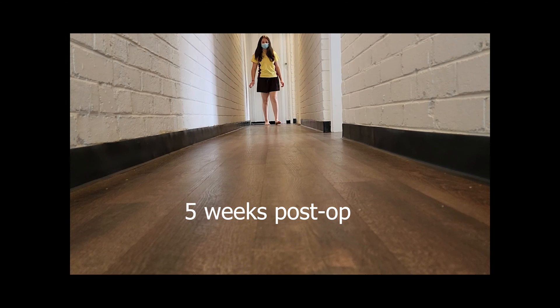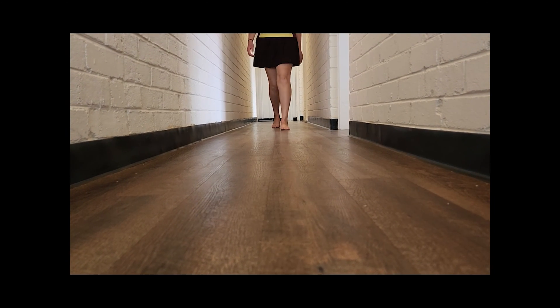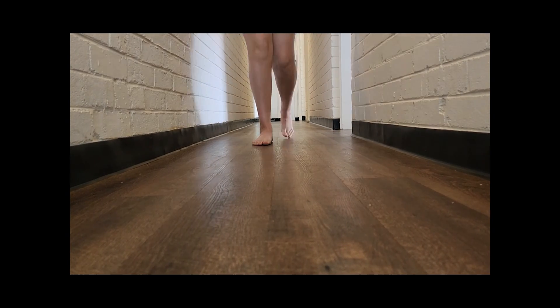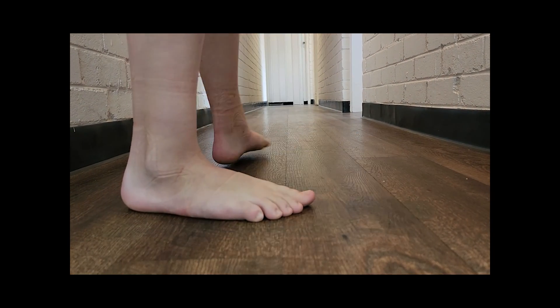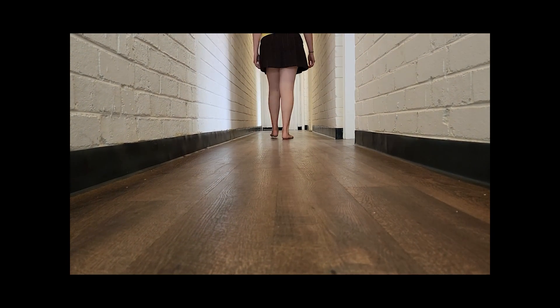The surgery was on the 4th of August, and we're now in September, so it's just over about five weeks post-op.